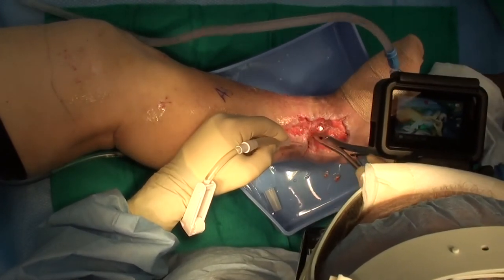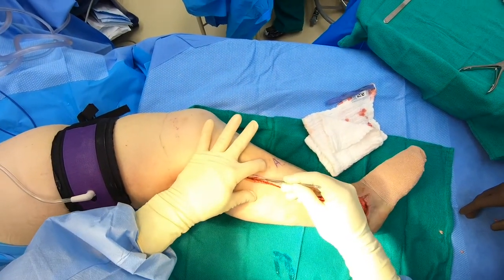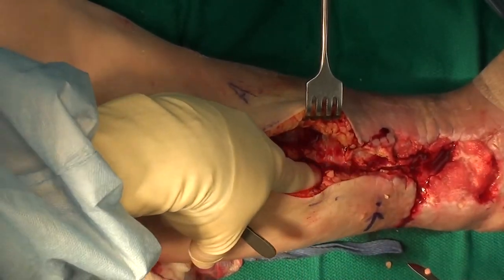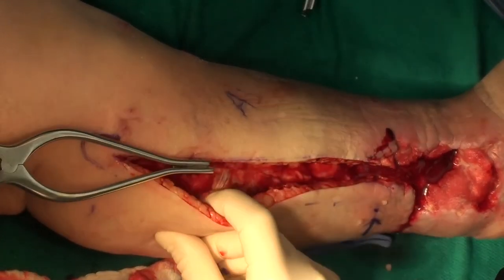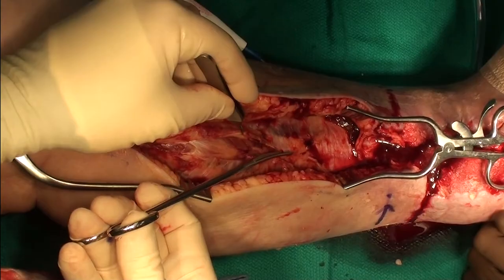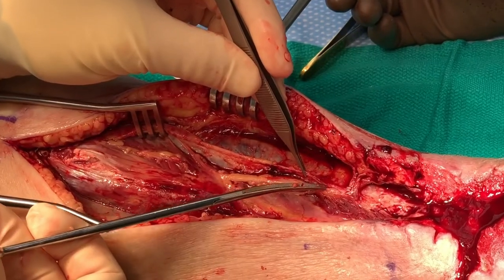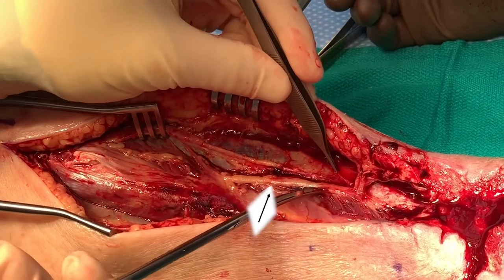Once the recipient site is thoroughly irrigated and debrided, the skin and subcutaneous fat is incised carefully down to the fascia overlying the lateral compartment of the leg. Soft tissue tension with gentle retraction of the skin edges facilitates exposure of the lateral compartment fascia without inadvertently going too deep and entering the lateral compartment. We are careful not to disrupt the deep tissues posterior to the peroneus brevis within 6 cm of the tip of the distal fibula. We gently place self-retaining retractors to hold the skin flaps apart. We then carefully incise the fascia over the lateral compartment, exposing the peroneus longus muscle and the superficial peroneal nerve running along the anterior portion of the lateral compartment. In the lower third of the incision, we are careful to identify and preserve the superficial peroneal nerve as it exits the fascia of the lateral compartment.